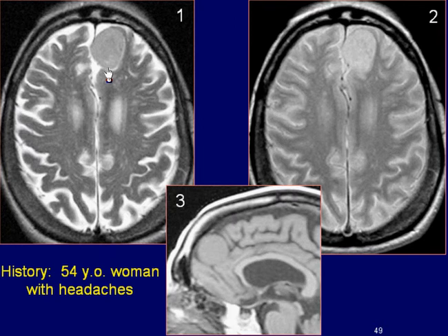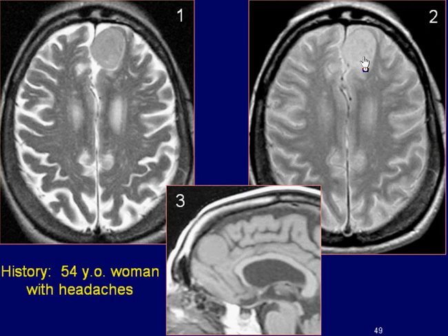The lesion is of intermediate signal intensity on T2 and slightly hyperintense on proton density weighted images with mild internal heterogeneity. The sagittal T1 weighted image demonstrates the midline frontal mass lesion as isointense to the brain.